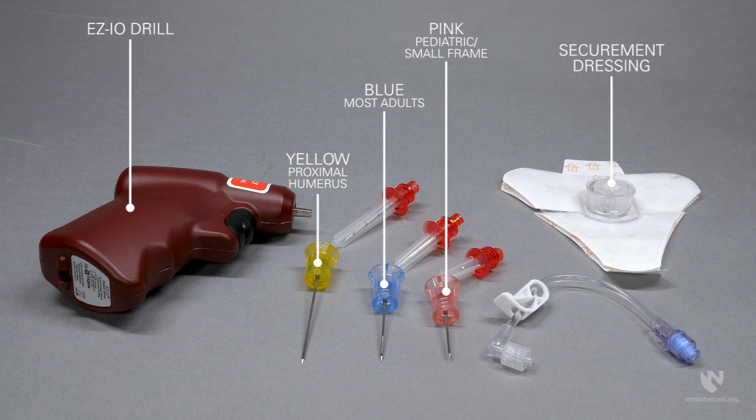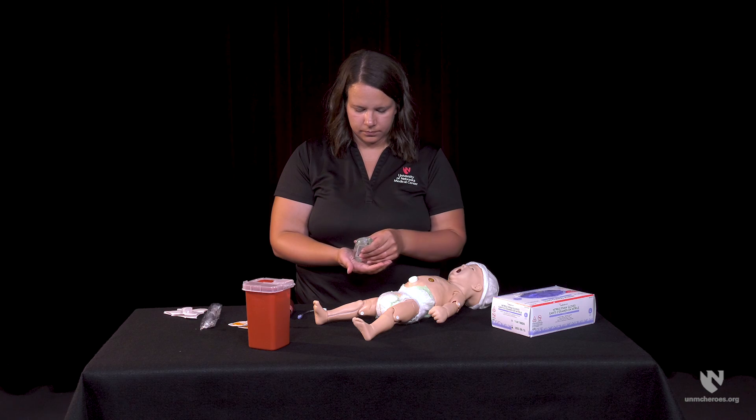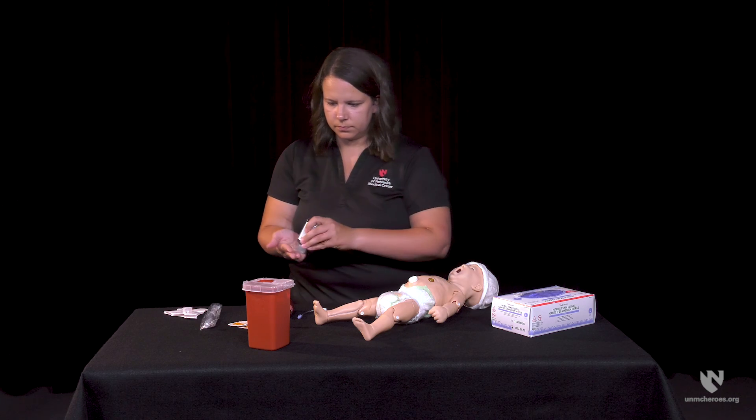You will also need a securement dressing and an extension set that will connect to the catheter. Prior to the placement of the IO line, perform hand hygiene and apply personal protective equipment.